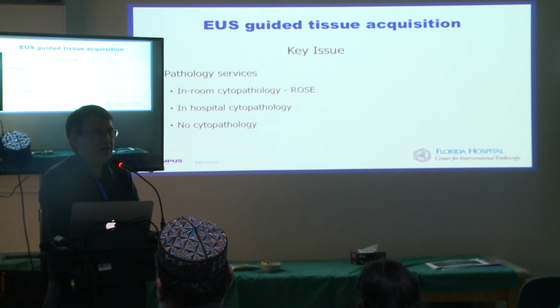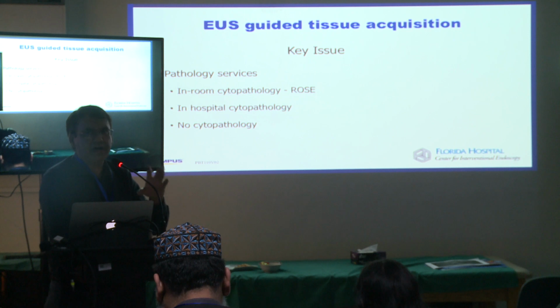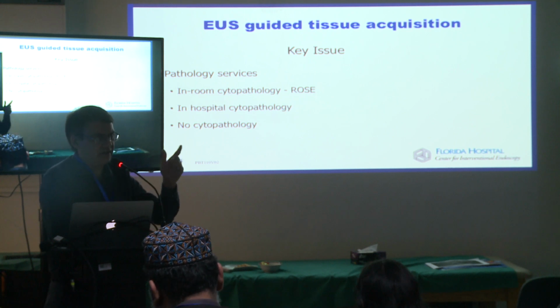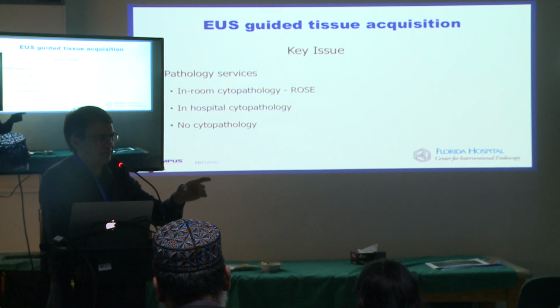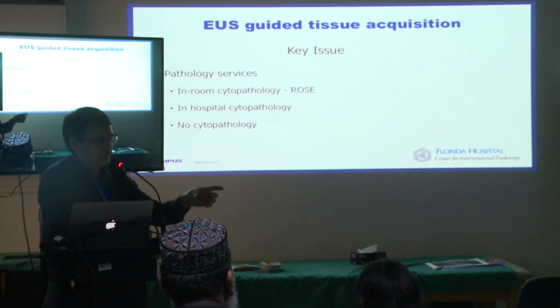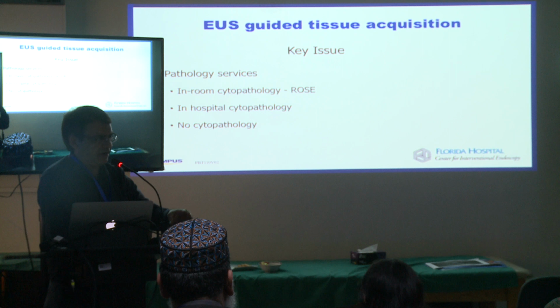So that's one: either they are available to come to the room, or, like here in this unit, they just make their own slides and then send those to the lab. I don't know, Gaspar, do you have the same setup too? Like you have a cytotech who comes and makes the slides, but you don't have a cytopathologist. Oh, you have it. This is the same way they have trained their people.